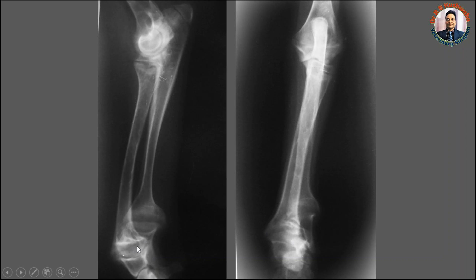Cupping is very clear in the anterior-posterior view. In the anterior-posterior view, you could see here — this is the mushrooming or cupping of the distal metaphysis of the radius, whereas this one is the cupping or mushrooming of the distal metaphysis of the ulna. You could also see there is an increase in the thickness of the physis, and there is also a decrease in the thickness of the cortex.